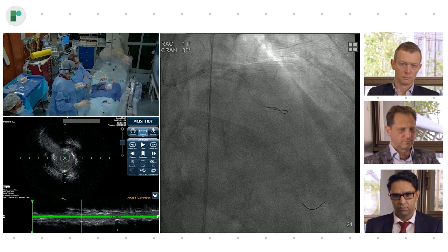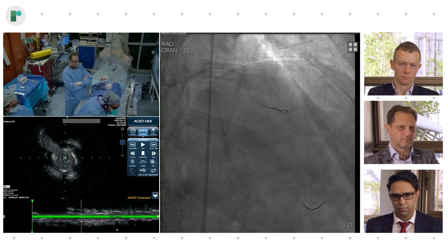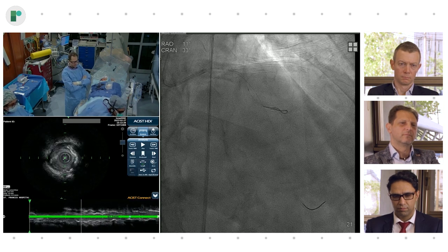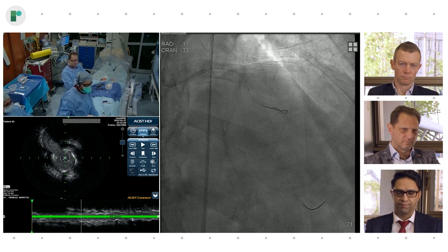So, Alan, you want to, we don't have an angiogram. No. But there's a septal branch at which the artery suddenly tapers, and we can see it on the old film here. And so now, just to point out one thing, what Ziad is doing is he actually took a syringe, he undid it, and he's using the black rubber inside of the syringe on the touchscreen of the assist. So this way we don't need somebody to help us. We can manipulate the measurements on our own.